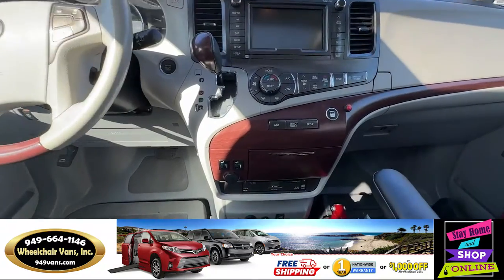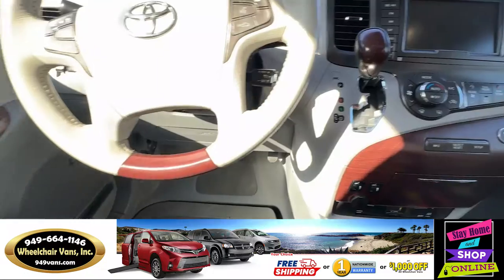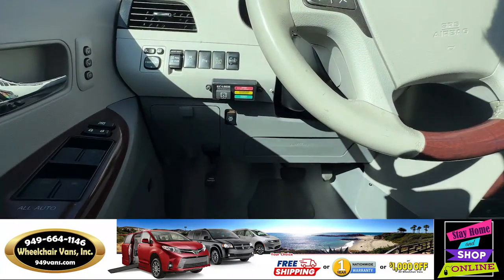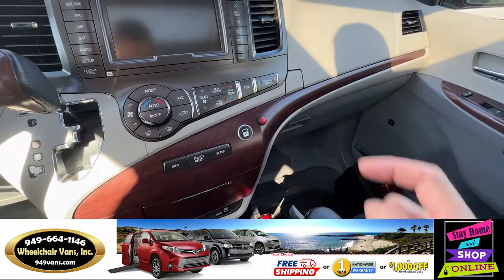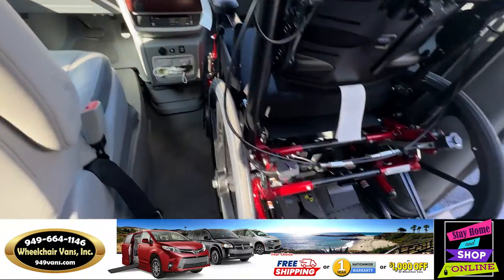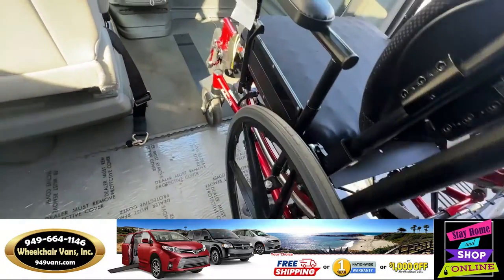On the dash you will notice two new buttons. These two buttons are going to be used to unlock the chair — for example, you will hit this button here. The system will announce 'Chair unlocked. Please roll back.' Now you can just roll it out straight back.